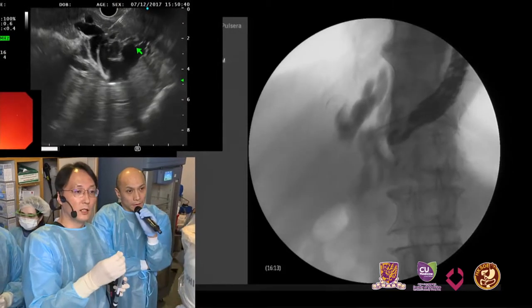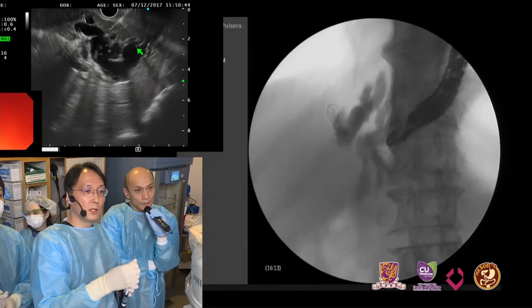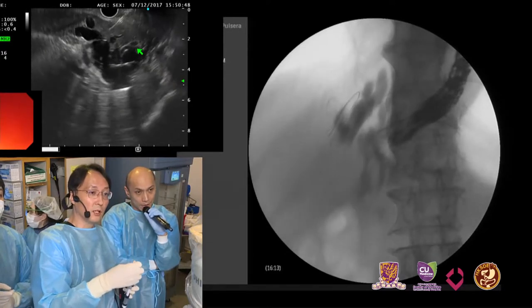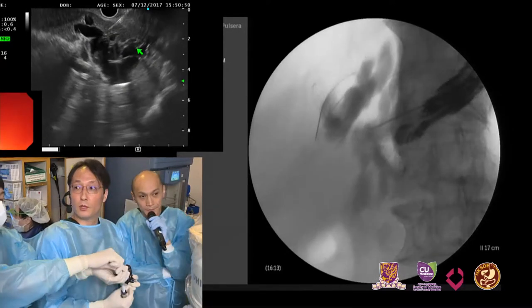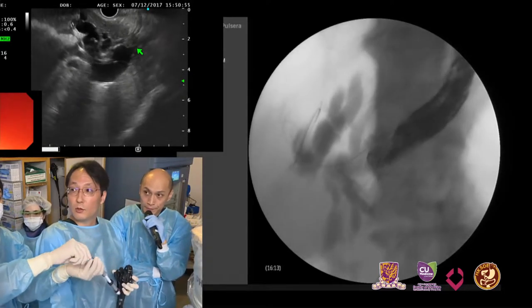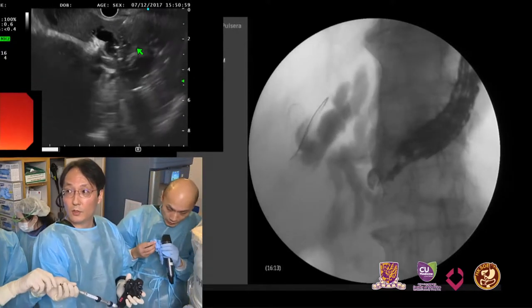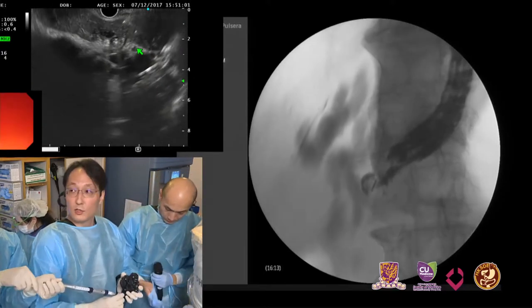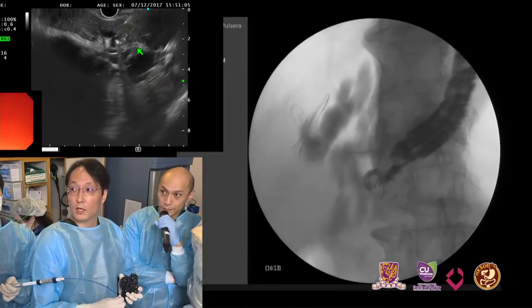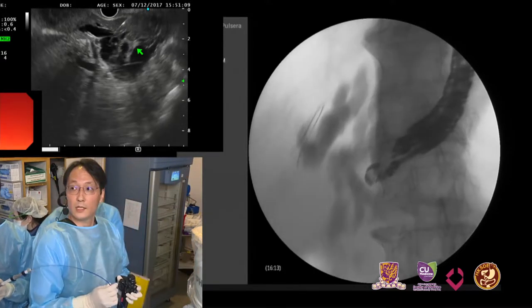Sometimes we can pass the guidewire through the hilum, through the transpapillary, sometimes possible, but this patient is a very difficult one. Seems like very tight at the hilar level. Then we change by withdrawing the needle. Okay. Then we are using the one-step device. For standard deployment, the scope should be fixed, and there is no change of the scope here. It's like this one. So you keep the wire in the EUS view, right? Right.